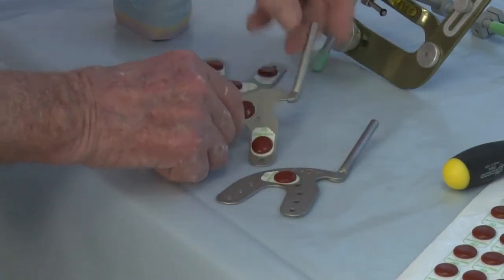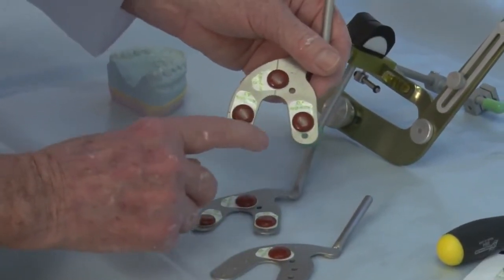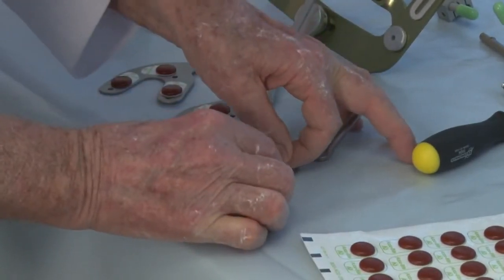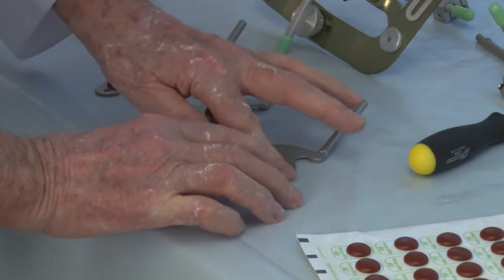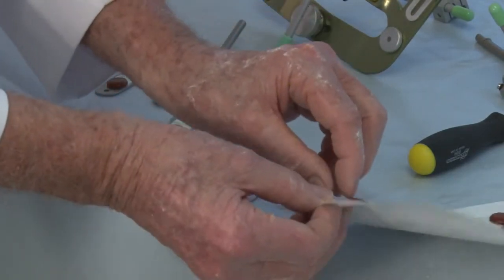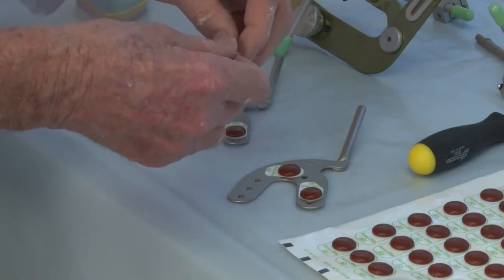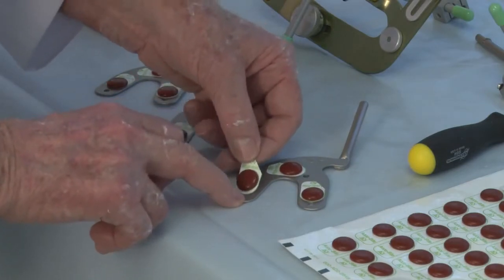Now, looking at the posterior section, you see the AccuBite, we have one hole still back here. This would be on the 6-year molars. Place them with a little pressure, because what you're depending on, these AccuBites, the paper is sticky on the bottom. There's a glue on the bottom. This is very sticky. And so you're depending on the glue to hold the AccuBite onto the bite fork.